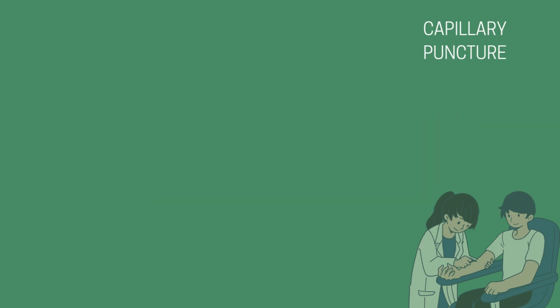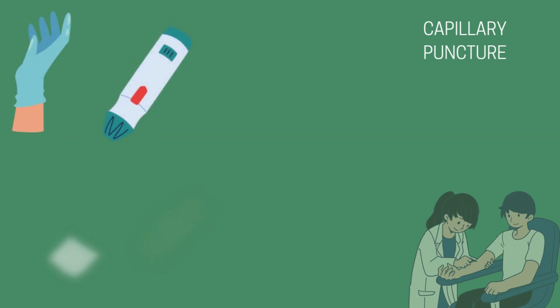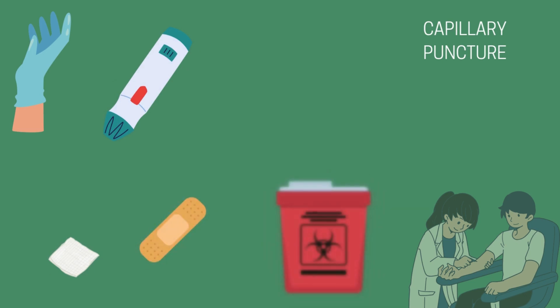The supplies needed for a capillary puncture include gloves, an alcohol prep pad, a single-use sterile lancet, gauze, a bandage, a sharps container, and any collection devices you may need, such as a capillary tube, micro-collection containers, or cartridges that will be used in various machines. You may use optional warming devices on the body part you will be performing the capillary puncture on. Warming up the site helps to increase the blood flow to that area.